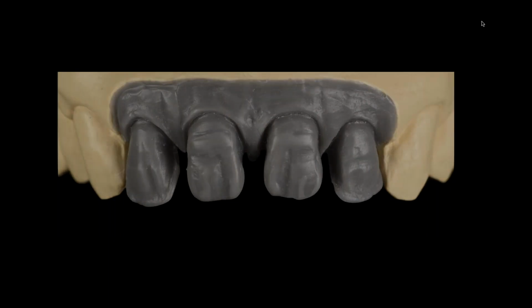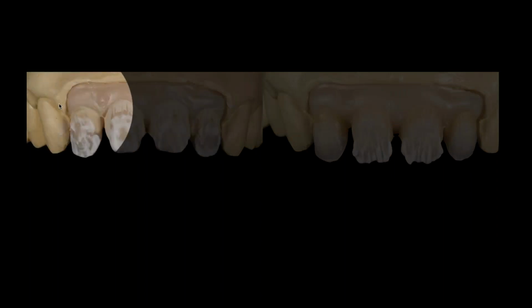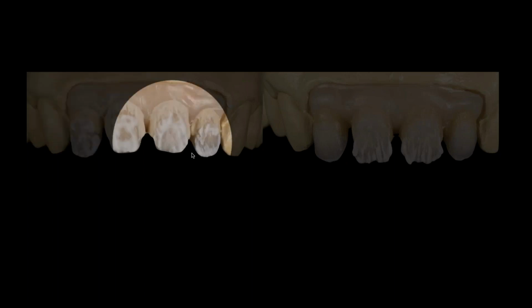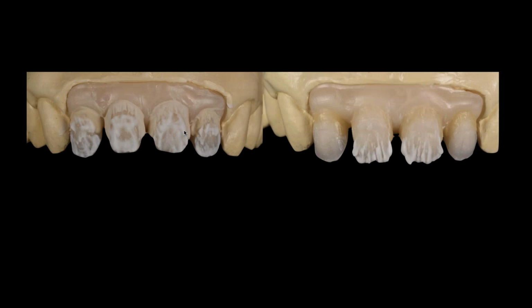So I could do that today very easily, and then it's really about layering and colorizing and how I'm going to manage my space differently. And again, you'll notice here that in this particular space, I'm going to go with a lot more chroma and a lot more bluish grays on the laterals. Why? Because I don't have the same amount of space to work in, and even though I have a translucent frame, I still need the ability to mimic nature and mimic light transmission. On my centrals, I have plenty of space. I have my 1.2, I have my 1.5, and all I'm really looking to do is reflect and absorb light in the areas and manipulate my light throughout the process.